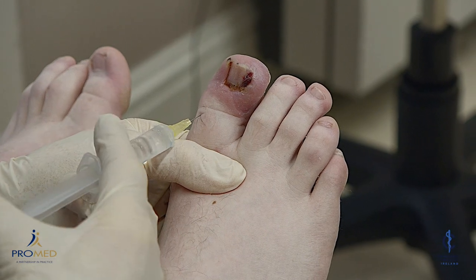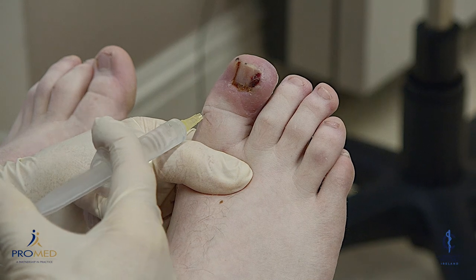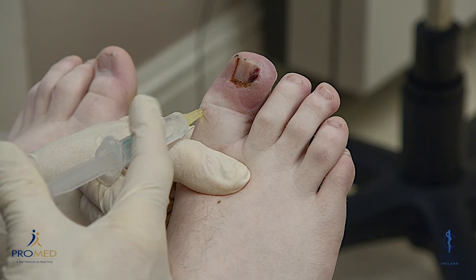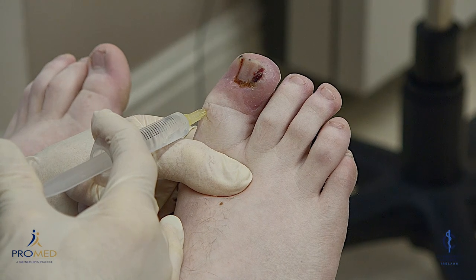I'm going to aim to put about one ml down the side here. It's a bit sore — can you stick it? Bear with me. A lot of pressure — you have to push hard.